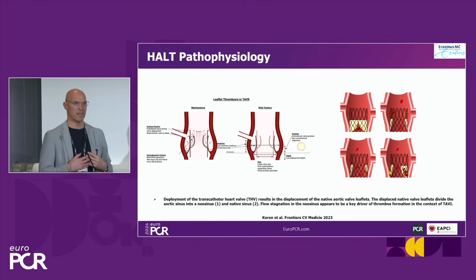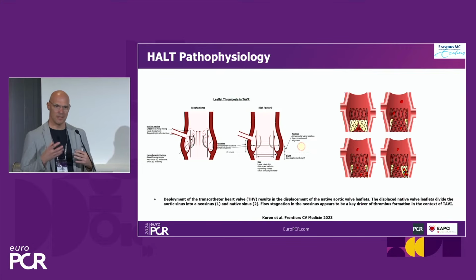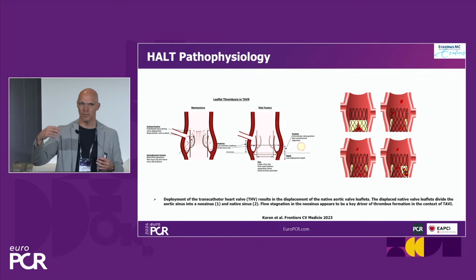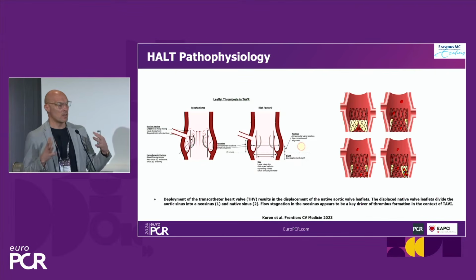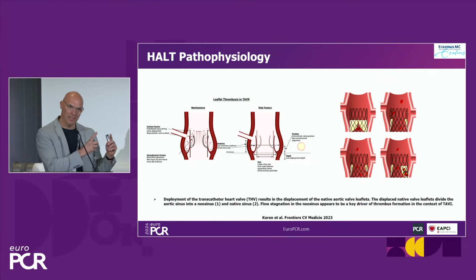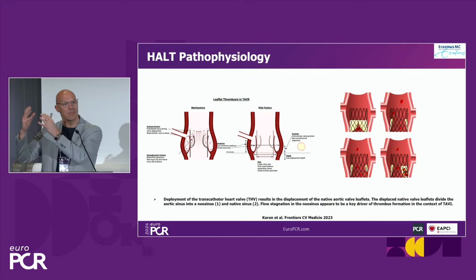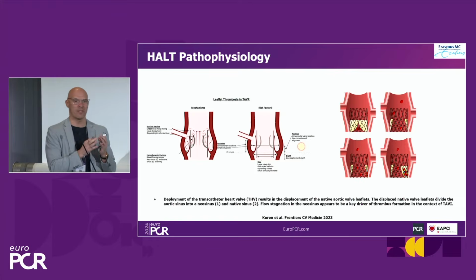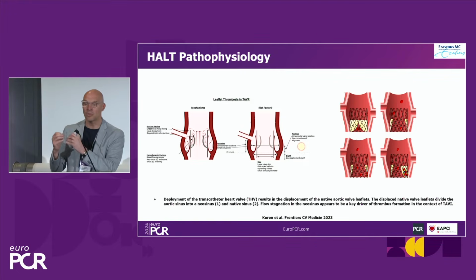and the stasis of blood can result in the thickening of the leaflets. Now, thickening of leaflets by itself may not be a problem, but this thrombus may trigger an inflammatory response, and that inflammatory response may eventually result in calcium depositions. That is the reason why we are a little bit excited and a little bit concerned with an observation of HALT by CT scanning. But for now, there has never been proof of a direct link between HALT and, for instance, valve durability. But there are reasons to believe that HALT is something real and that it does create calcification that is different from conventional structural valve degeneration.